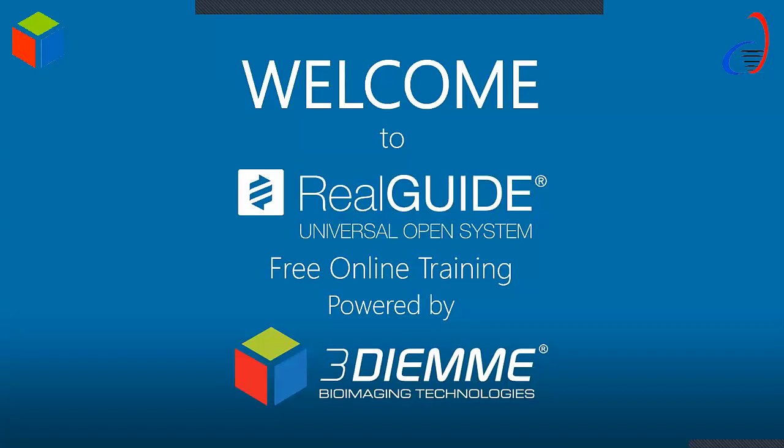We're providing free daily webinars to our Italian customers where we face different topics every day. And since our goal is to expand our business also in foreign markets, we have organized this first free webinar in English, and we hope that it can be useful for you to better understand our complete digital workflow and the cutting-edge solution proposed by our company.